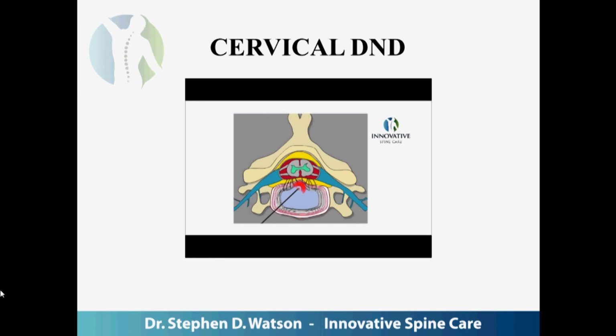As you see here, the nerves are being turned off or killed. The blood vessels, which we don't show in this picture, are being sealed so they can no longer bring those inflammatory compounds to the disc and into the disc itself. And finally, they are hopefully causing the disc bulge or herniation to shrink, thereby potentially relieving pressure on a segmental nerve, or at least by decreasing the inflammation in the canal to diminish the radicular symptoms that a patient might feel.